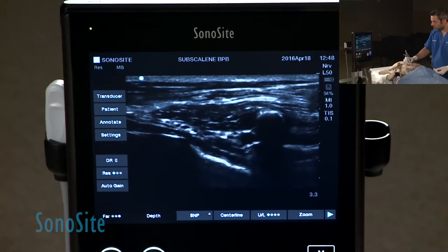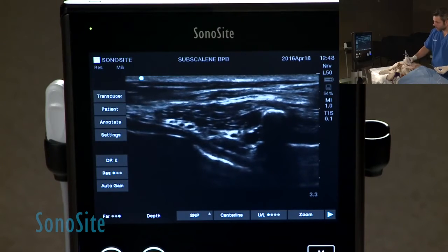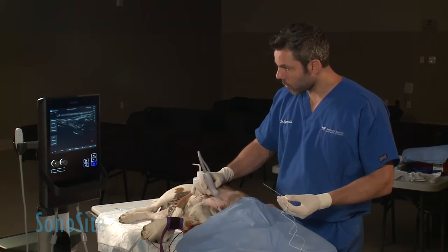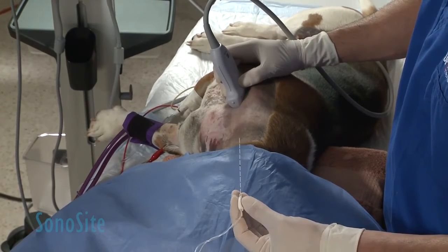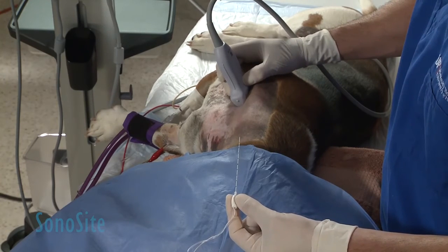Notice that there are two major arteries cranial to the first rib — the vertebral artery and the cervical costal trunk — just under those nerve roots. From left to right you can see the roots from C6 to T2. There are already innervations splitting out in some ramifications in there, which is why you don't see only four or five dots.